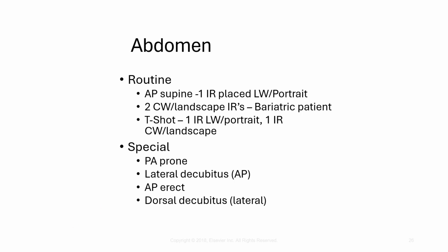Now, before we get into this, some of the special patient considerations we have to think about are pediatric patients. For pediatric patients, the biggest factor is probably time and using the shortest exposure time possible. Typically, if a child is under 12, there's a significant reduction in kVp and mAs. Over 12 or 13 years of age, they are getting closer to an adult body habitus, and the reduction would not be as significant.